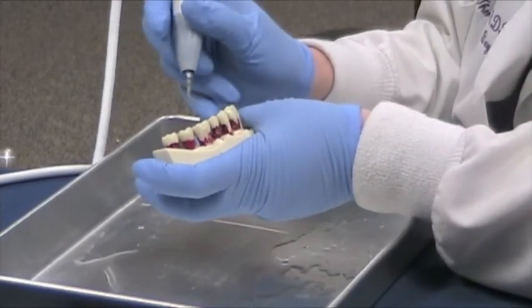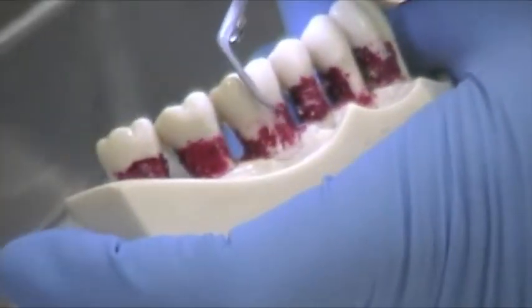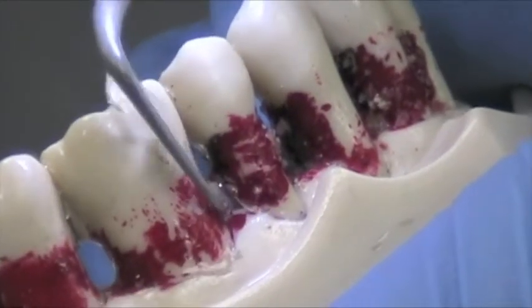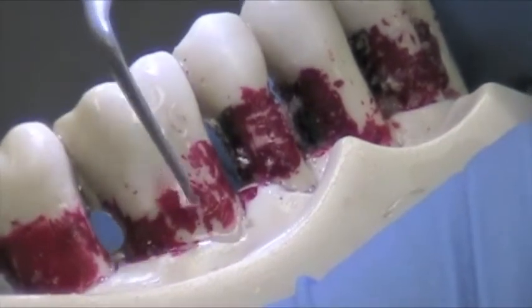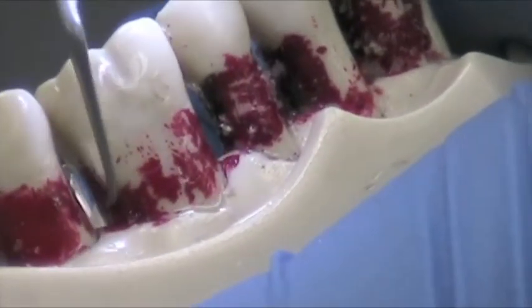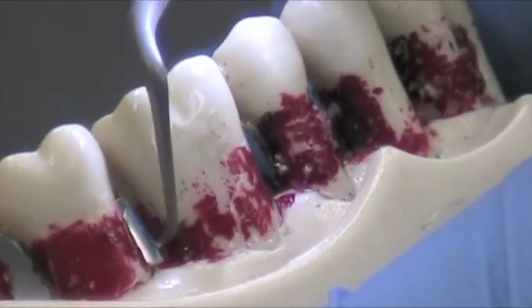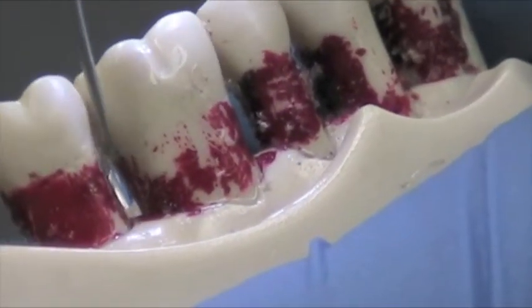We're now going to demonstrate the PH2L tip. This is for posterior implants. Going right along the mesial here, along the buccal, and then back along the distal. It's great for posterior implants, for composites, for veneers, and full mouth rehabilitations. And this concludes our PerioSoft kit.